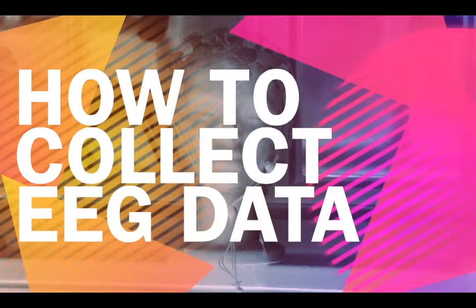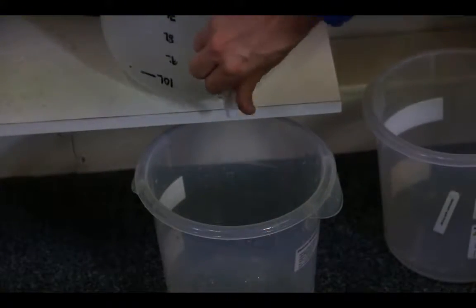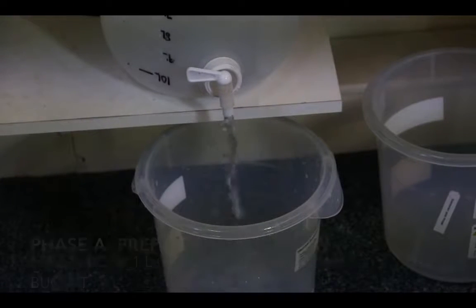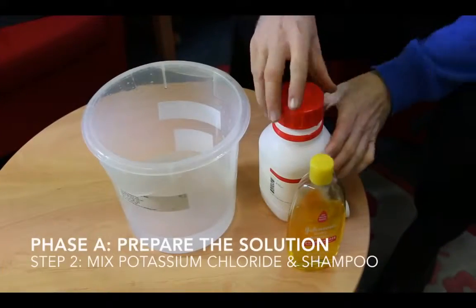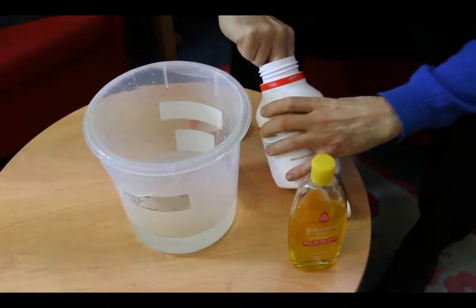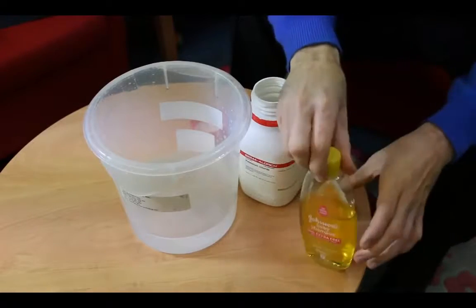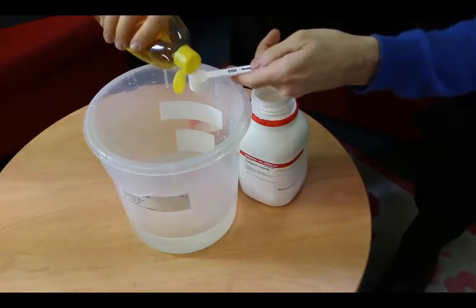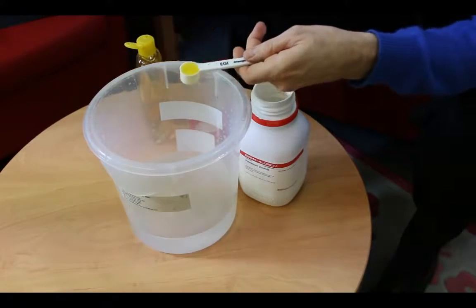Now that we've been introduced to the basics of EEG, let's talk about how to collect EEG data. The first phase is to prepare the solution. You want to start out by filling a bucket with 1 liter of distilled water. Next, you're going to mix in potassium chloride to increase the electrical conductance. You're also going to mix in Johnson's baby shampoo to soften the scalp of the participant and decrease electrical impedance. Be sure to mix thoroughly.